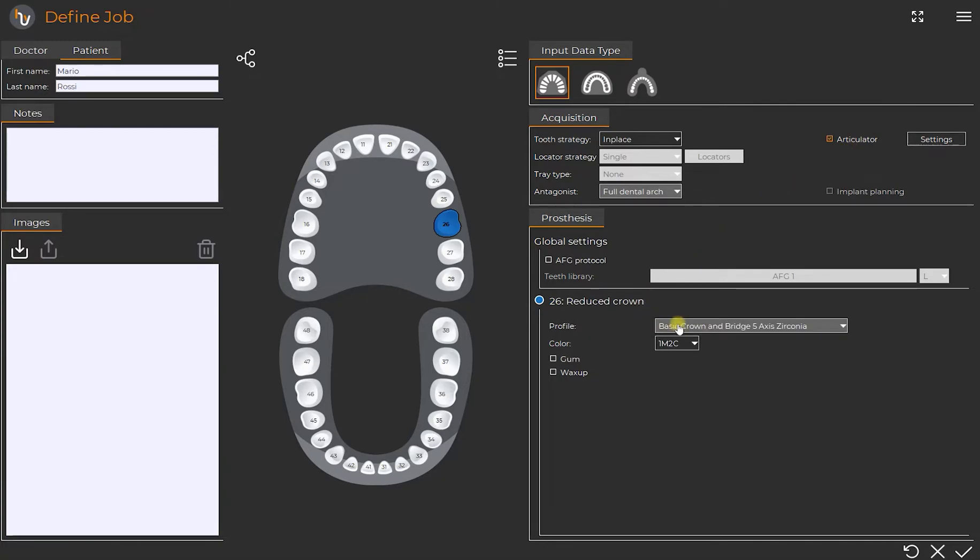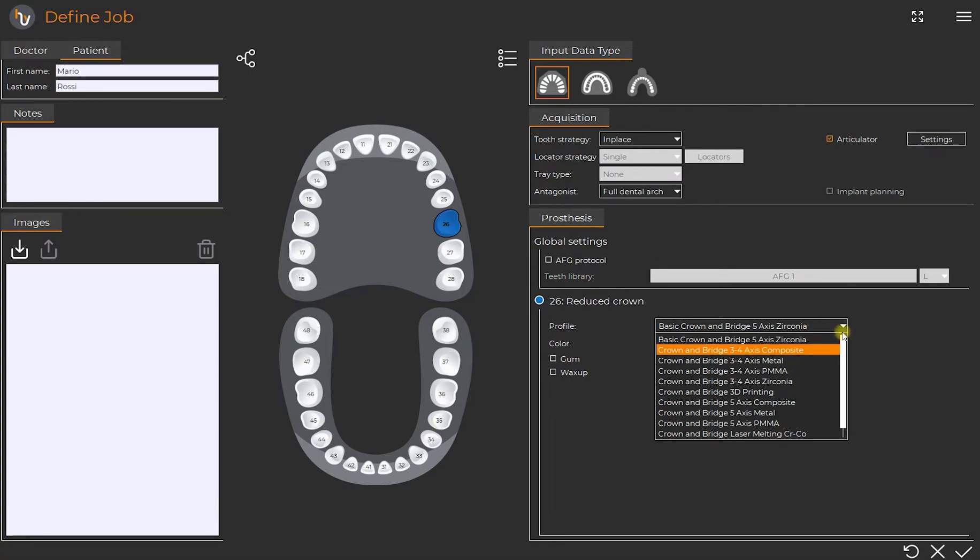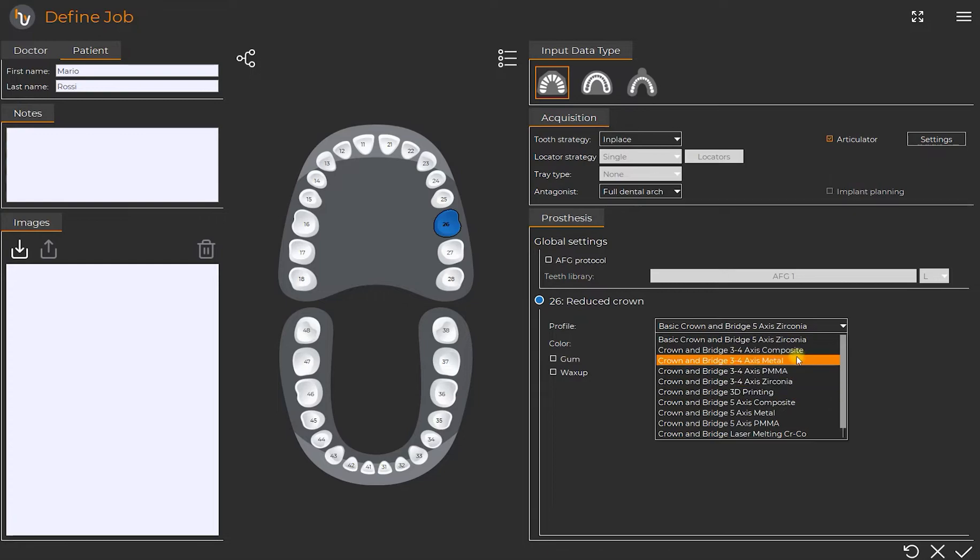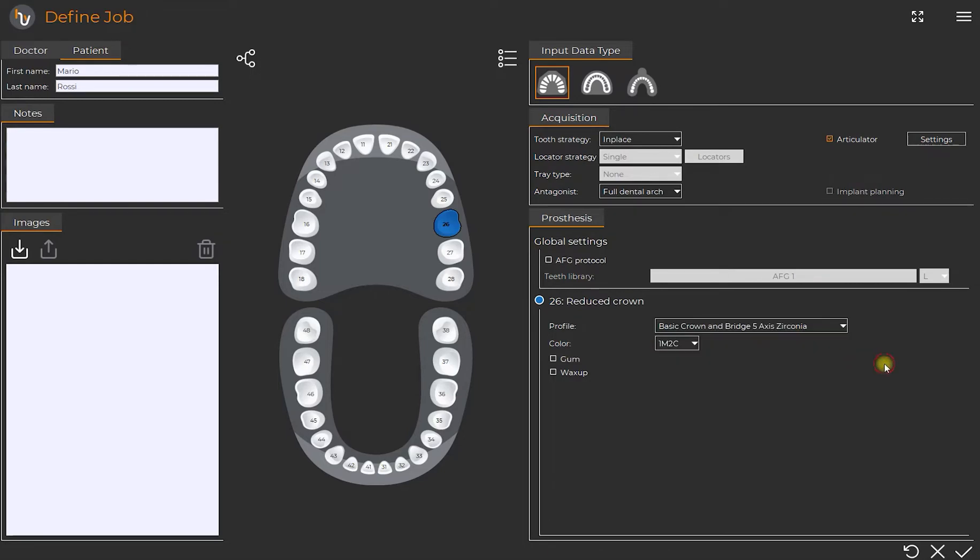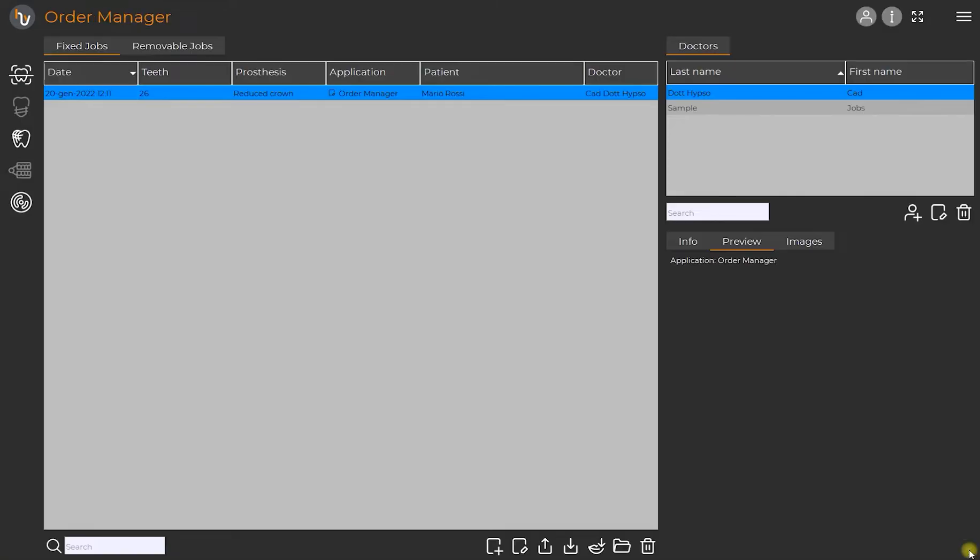Going down we find the settings regarding the default choices which can be managed also by selecting the profile previously created from the profile manager. We confirm by clicking on the OK button on the bottom right and we proceed to the CAD phase from the vertical menu on the left.